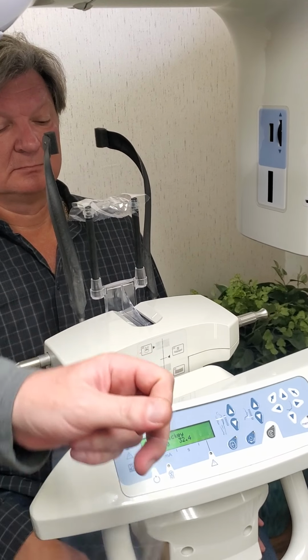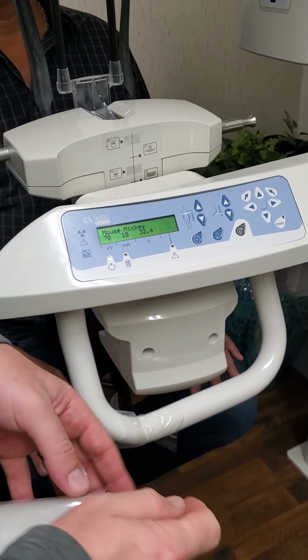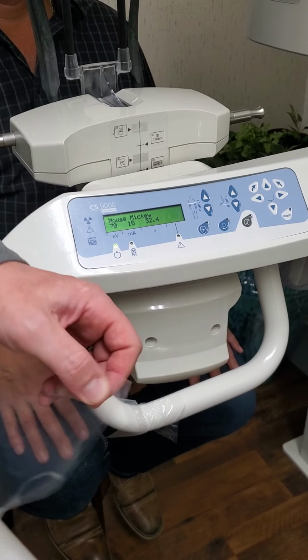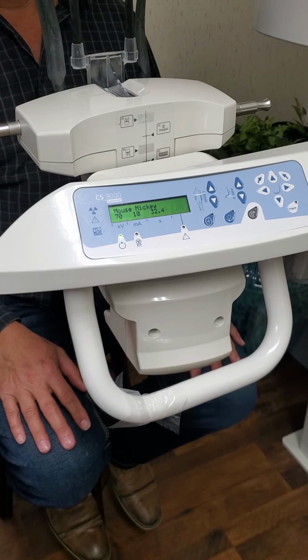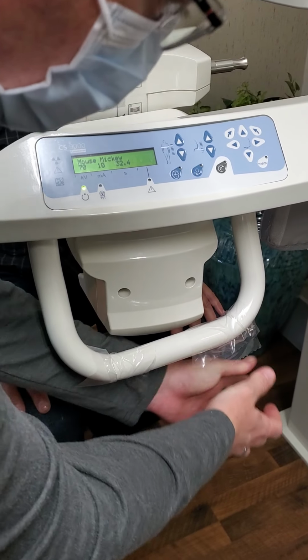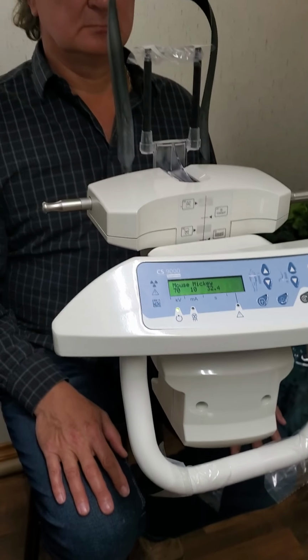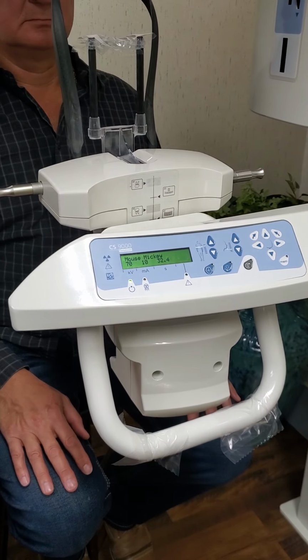We'll barrier the bite block and both handle positions. Make sure you protect your patient.